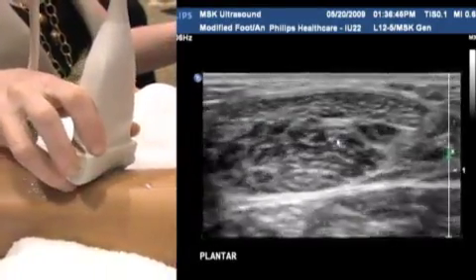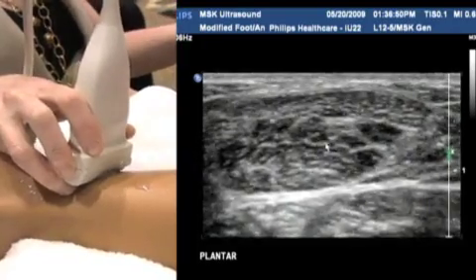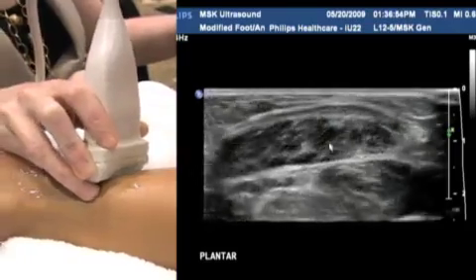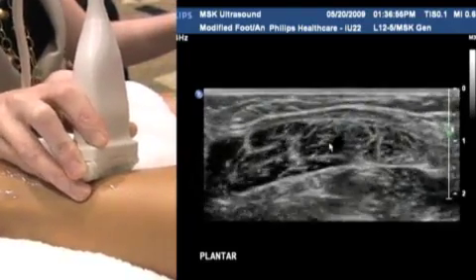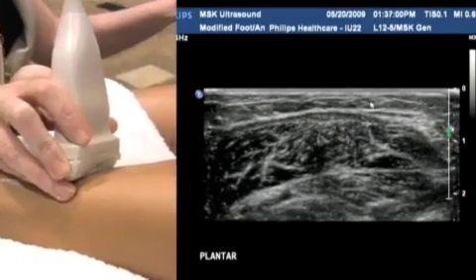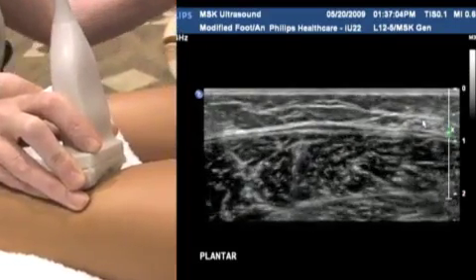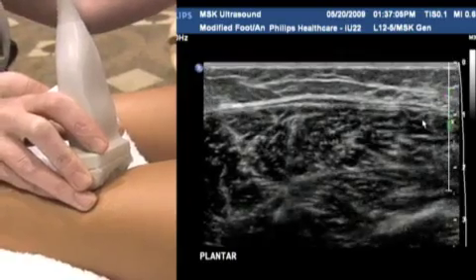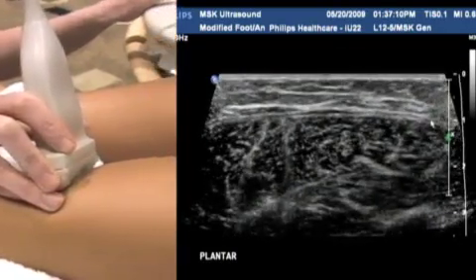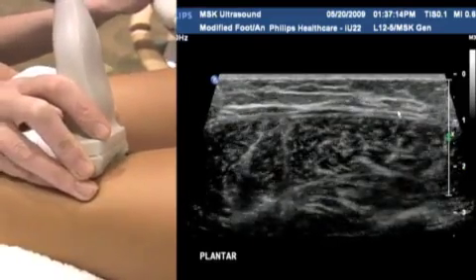Again, as we move proximally, you'll see the Achilles tendon start to spread over its muscle. Quite normal. Let me just take it off the zoom so we can appreciate that a little more effectively. You can see the tendon gets really wide over the top of the gastrocnemius muscles there at the back. You can see it gets really thin proximally, stretching all the way out.